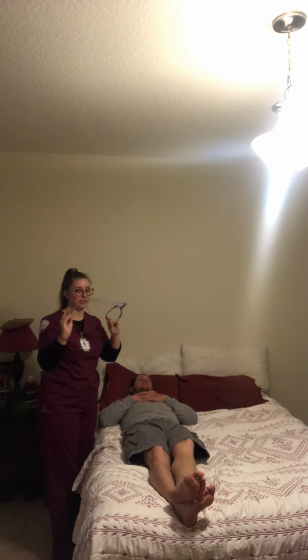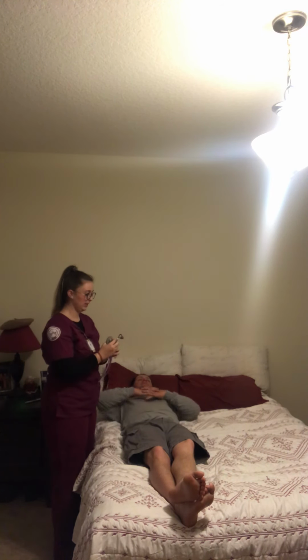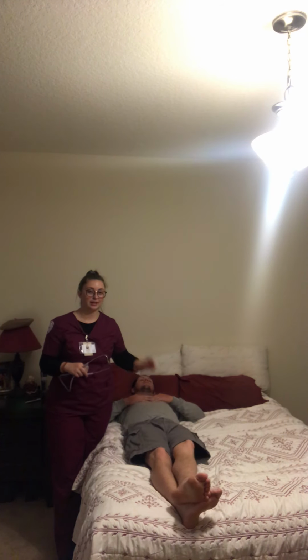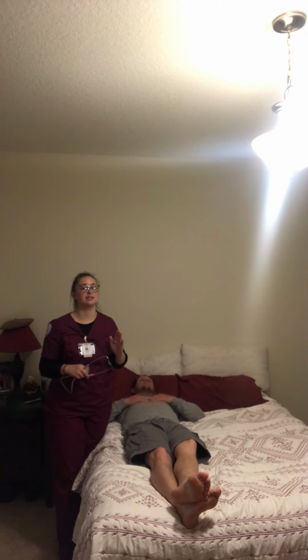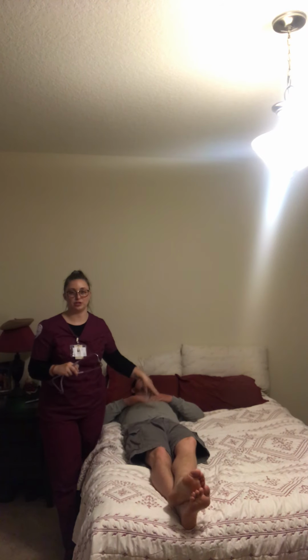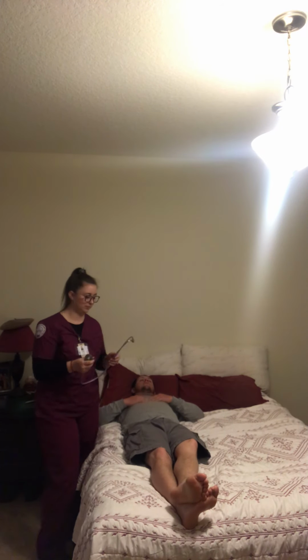I'm going to listen first. I'm going to listen to the bowel sounds for 1 minute in each quadrant. I'm looking for normal sounds of 5 to 30 per minute, and anything less than 5 is hypoactive, which means I would go back and listen in each quadrant for 2 minutes each.